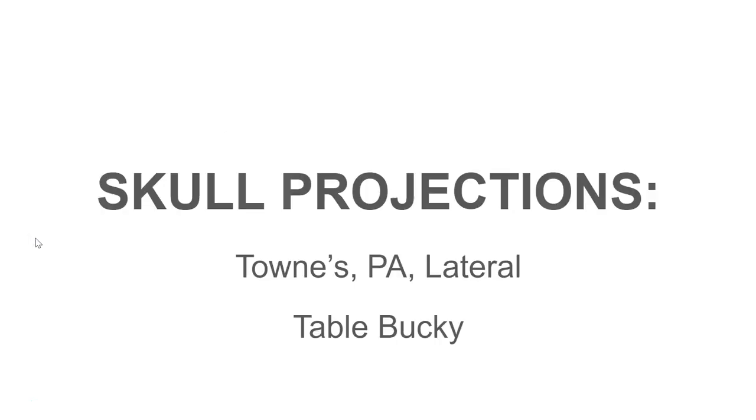Now, the skull projections that we're going to use or check off on in lab include the Townes, the PA, and the lateral. There are other skull projections. We are just not going to check off on them. So if you got an order for a skull projection that you weren't familiar with, you would have a Bontrager at work. Most departments keep a couple copies. And you would look up that skull projection and utilize the information you already know, such as the positioning lines and the landmarks, to complete that exam.